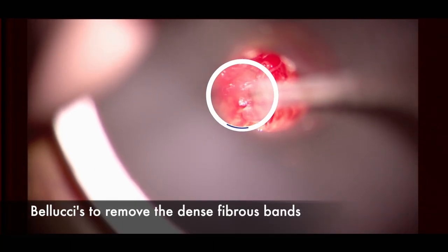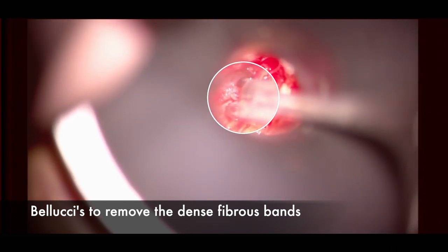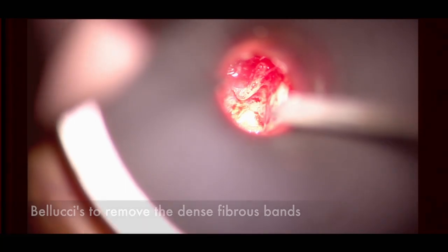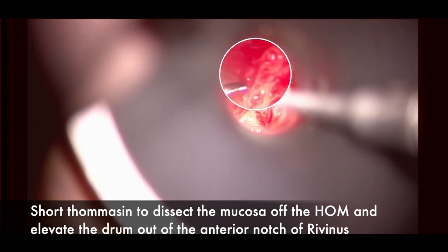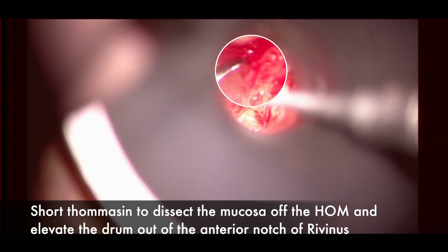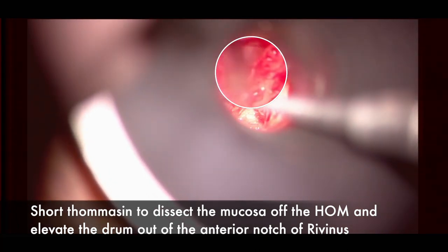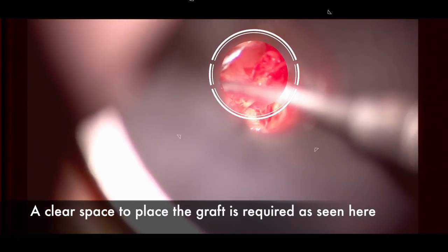Stripping the handle of the malleus allows cartilage to go all the way up anterosuperiorly in the graft. Fine straight Belluccis cut posteriorly, then inferiorly, then anteriorly to ensure all epithelium has been removed from the umbo. If concerned, a laser can be used on the tip of the umbo. Using a short Thomassin to lift mucosa anterosuperiorly is important — lifting all mucosa to show the lateral aspect of the protympanum so the graft can be confidently placed under the tympanic membrane in that region.